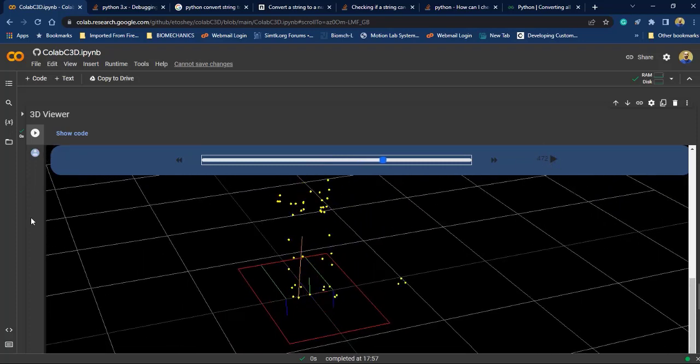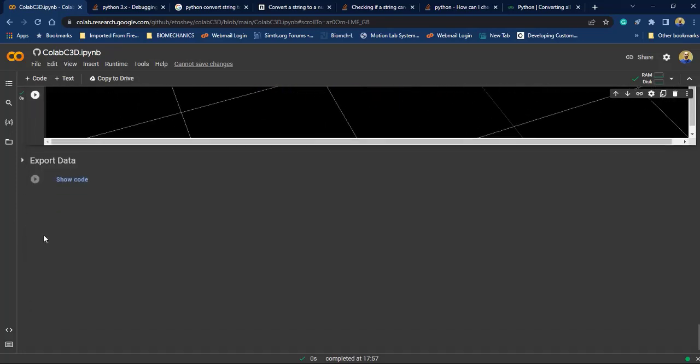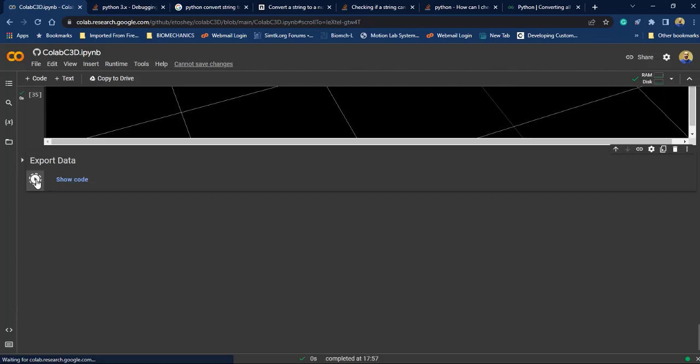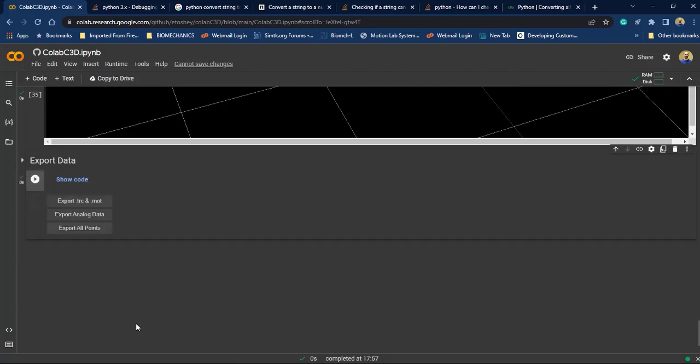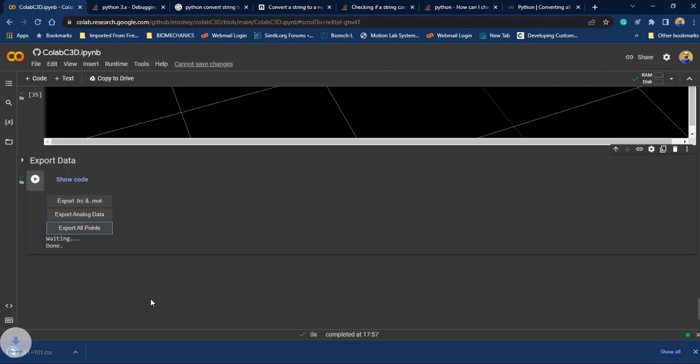At the final step you can export your data. Run this section. As you can see, you just need to click on each button. For example, if you want to export all marker positions or marker data click on this button. Or if you want to export the analog data or export your TRC and MOT file.